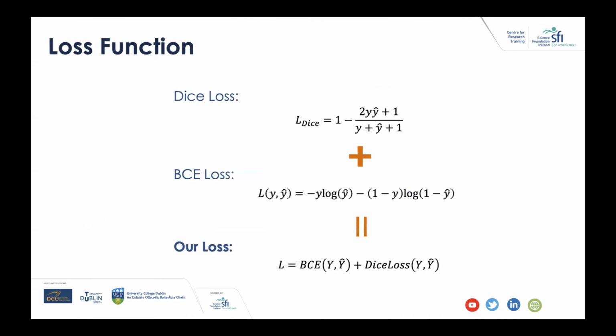We also changed the final loss function. In this challenge, we are more focused on the segmentation result, so we didn't use other loss functions. We just used the Dice loss and also the cross-entropy loss, and we put them together as our final loss function.